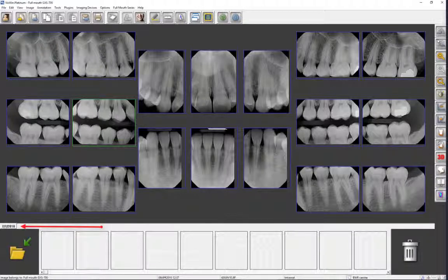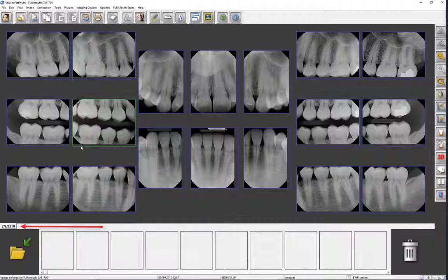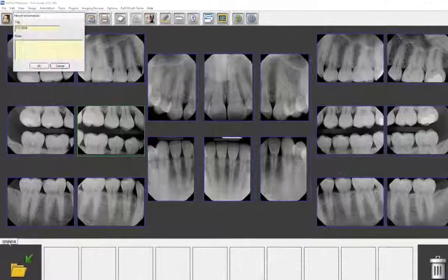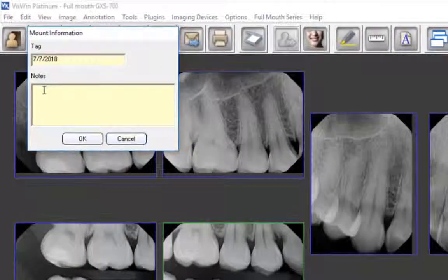On the date tab bar, tabs are created and dated when the template is selected. Each patient exam will have its own tab. You may right-click on a tab to add any desired notes or to change the tab name.